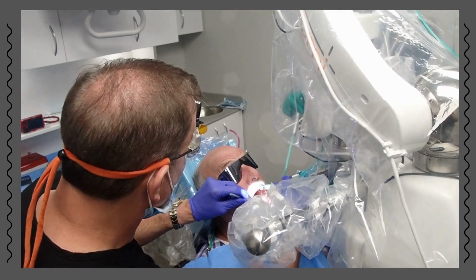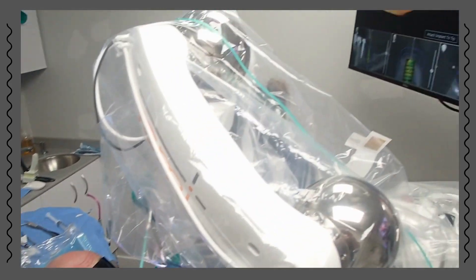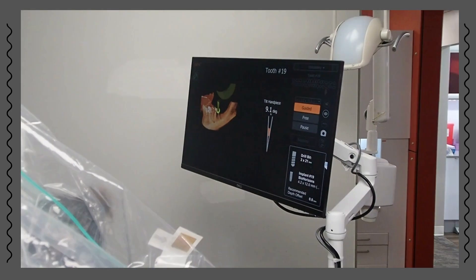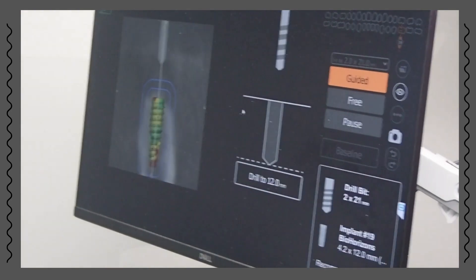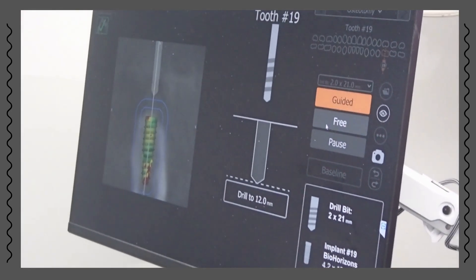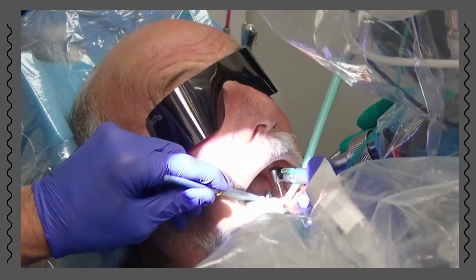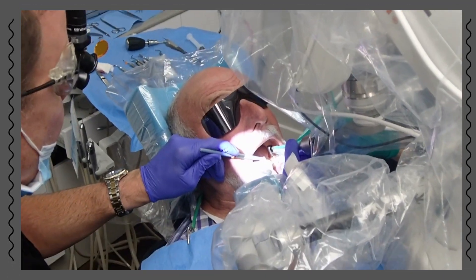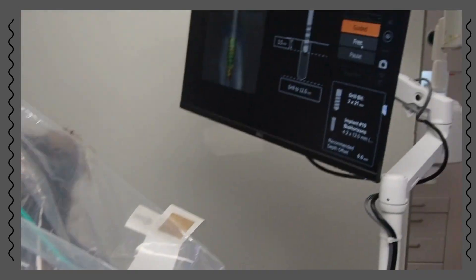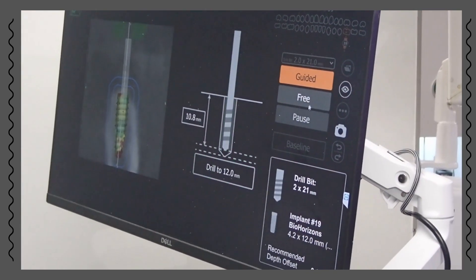Open real wide — good job. Guided. Guided. Towards the chin. Distal. Lock on. One, two, three, four, six, seven, nine, eleven — and that's three, five, five.